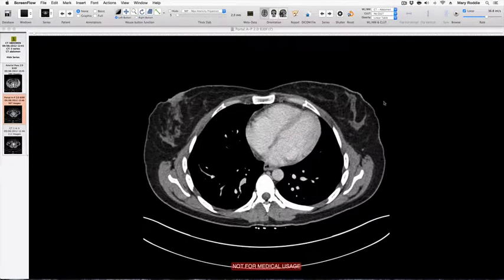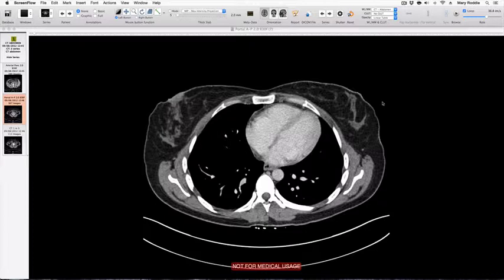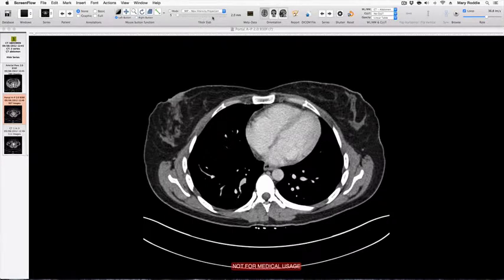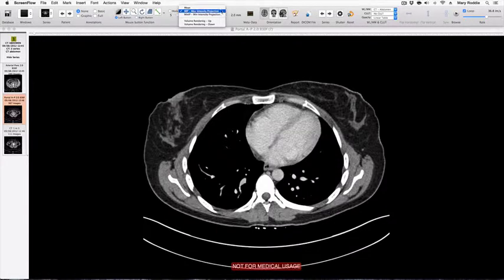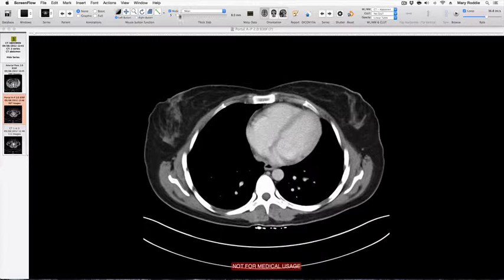Using that technique we have discarded two out of every three images, but there is another way to reduce the series image size and that is by thickening the slice thickness. The way to do that is to go to the top toolbar to the icon called Thick Slab and on the list of menu items you will see something called Mean.